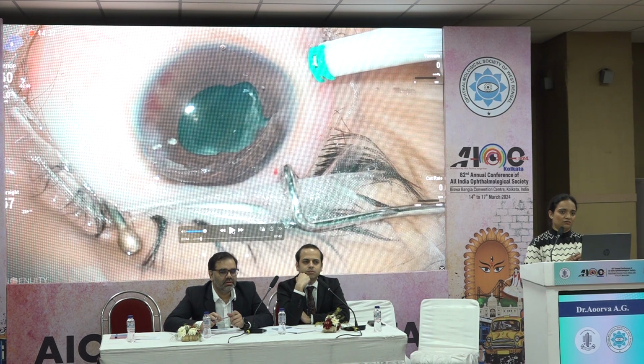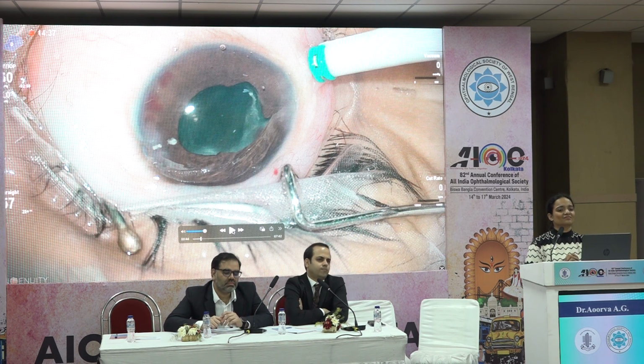So this patient had a cataract. PFV anyway has two predominant varieties. One is the posterior variety, one is the anterior variety. Well, you had the anterior PFV and the posterior stalk also. If you have predominantly posterior, then there would be more traction on the posterior part, and then you have the anterior PFV, which is your type.